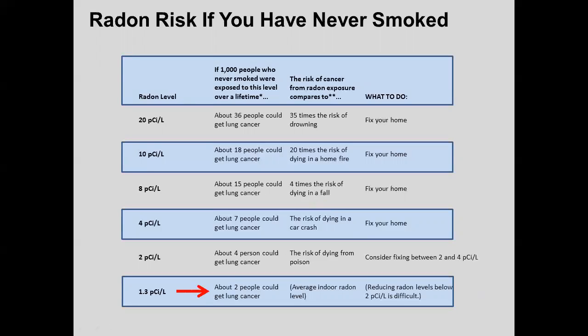And this one is interesting. How many people have tested their house for radon? Okay, I just did mine, I just got a new house, so I did it. And if you look at 2 in 1,000 people, so that's the same risk as the occupational risk of 5 rem, okay? And this is what they say, it's hard to reduce it to less than that level, even with good radon mitigation. So even just living in a house in Minnesota, your chance of dying of lung cancer is the same as if you get 5 rem of radiation from occupational dose.